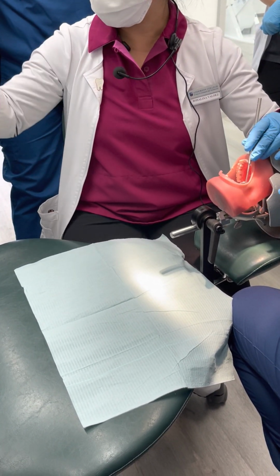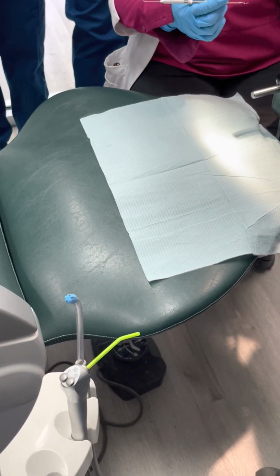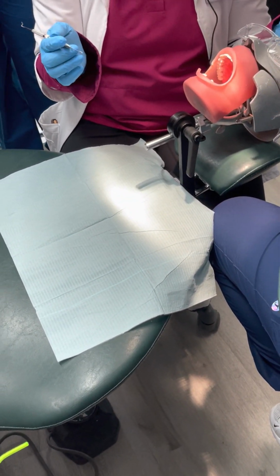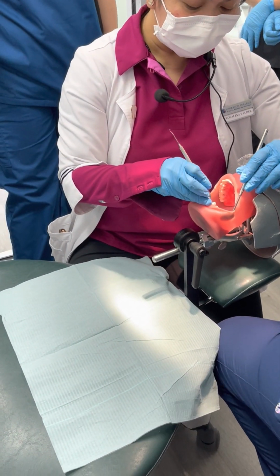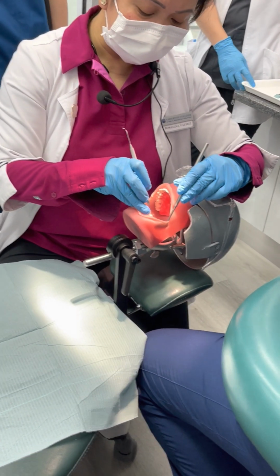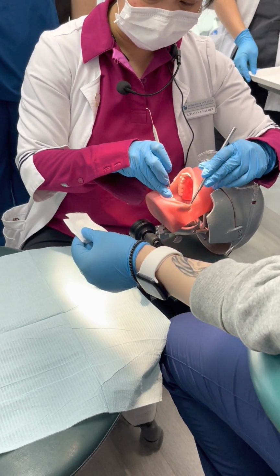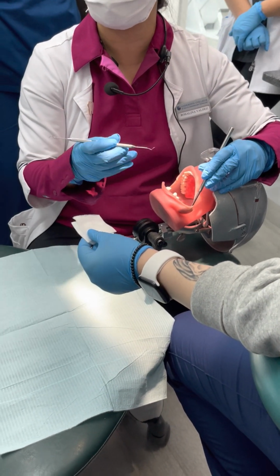Where's the procedure? You were not reading it. Okay, so what's the first step? I think we've done the first step. The next one is to receive the Explorer and the gauze. Now I'll do the checking to confirm that I'm working on 3-5, so I double check the tooth. Okay, this is the tooth. Now, what do you pass next? The dentist will not tell you, unless she's a nice dentist, but not most. They will tell you what he or she will use next.